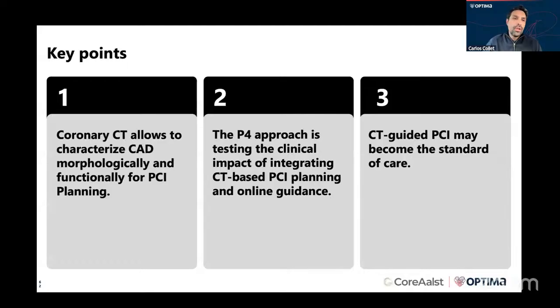So to conclude, and we have a few minutes still to have a good discussion, I think that CT has evolved in a way that is able to characterize CAD both morphologically and functionally. It's not anymore a rule out tool. This has really evolved, and I didn't show any of the new CT scanners, but that is just mind-blowing to see how the hardware is evolving.